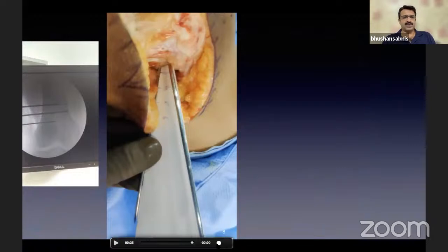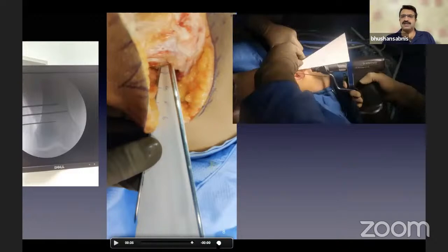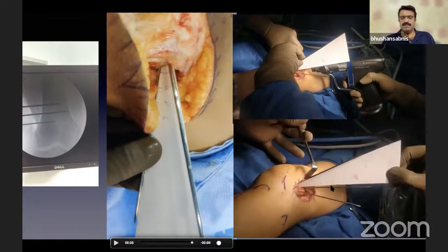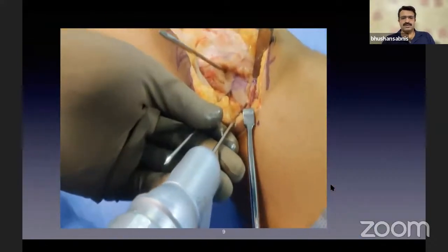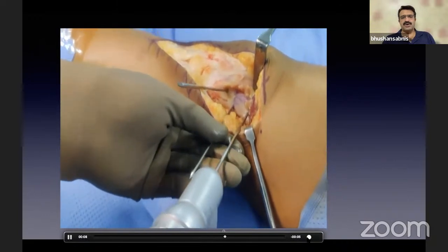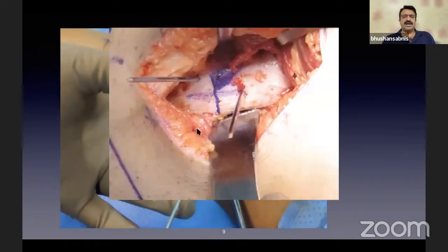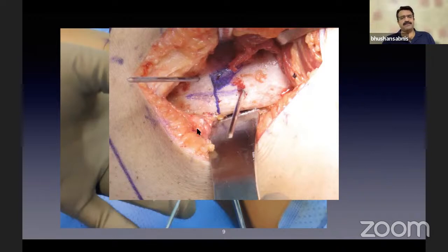Two wires are passed at the sides of the wedge, with the aim of getting these two wires parallel at the end. The central wire indicates the level of the osteotomy — a transverse osteotomy. You need to place your plate and confirm sufficient fixation in the distal fragment, perfectly parallel to the joint line; otherwise you can induce parallax and cause fixation problems. The two guide wires are passed along the correct intended correction on the wedge, with one more wire passed parallel to the proximal wire — the aim is to rotate the distal fragment until the wires become parallel.